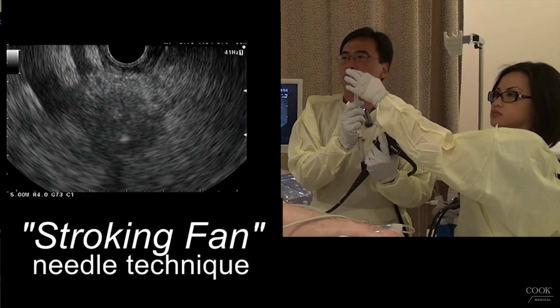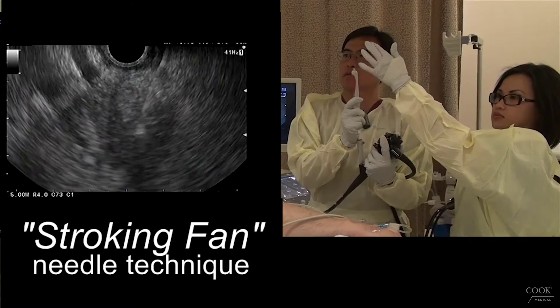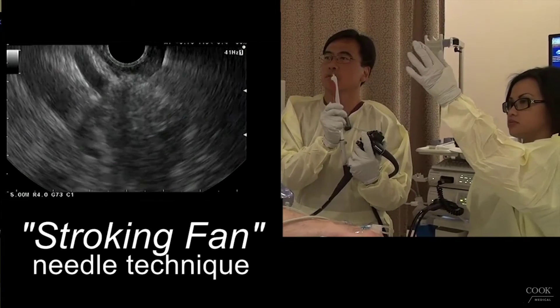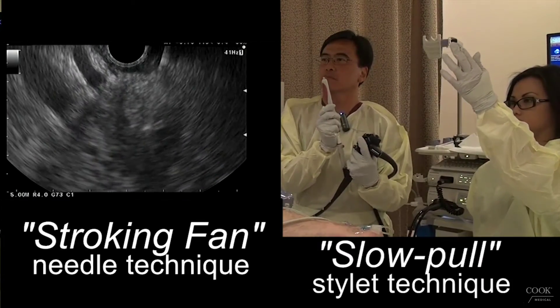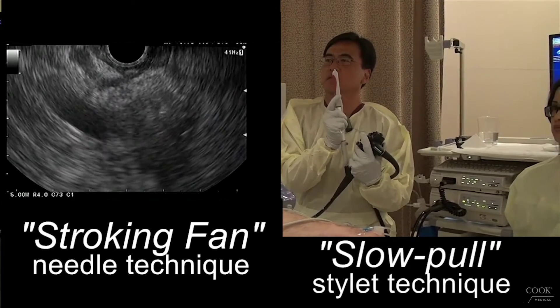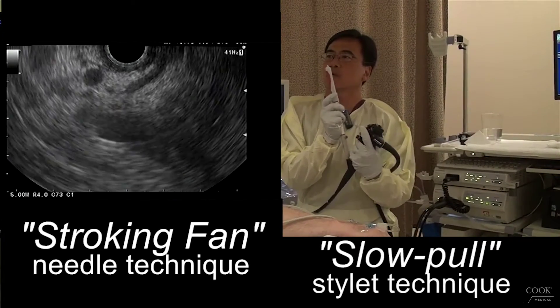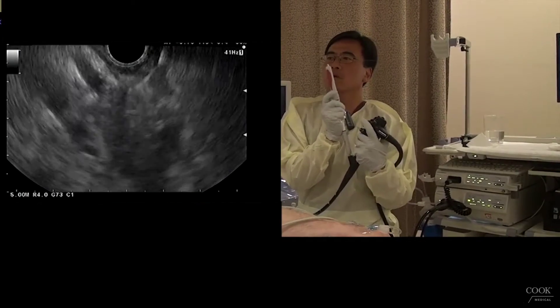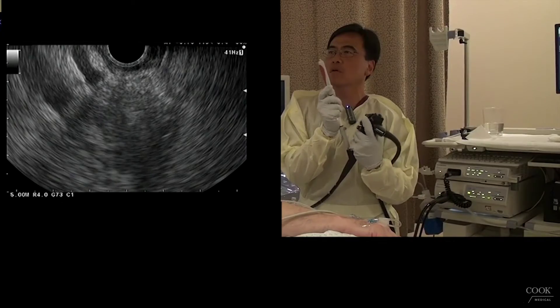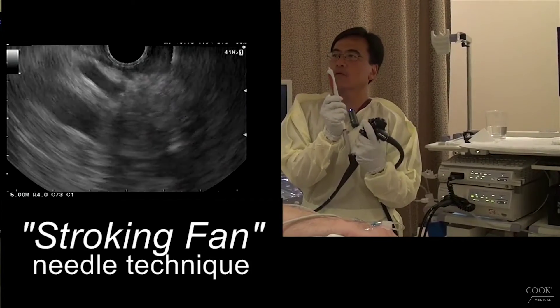Emily is going to start pulling. We're going to make nice, gentle to-and-fro. We're going to try to do a fan-like distribution to and fro. Emily is moving back slowly with the stylet as I push forward. The stylet is moving out — about 10 to 20 to-and-fro, and a fan-like distribution. We call this the stroking fan.